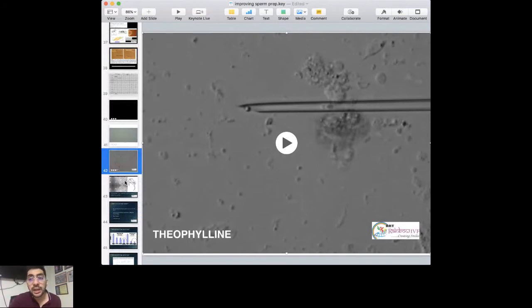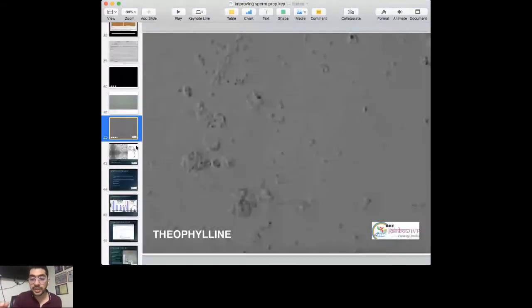Right, so this was mostly everything about sperm preparation. I'll quickly come to processing and freezing the male gamete. So what to use and when, because I'm sorry, I didn't cover the theophylline preparation. Generally, when I am using theophylline, I prefer what Xenia is saying, where I only introduce a drop of theophylline into the ICSI dish. That drop is sufficient to activate the sperms, and it helps me in my ICSI procedure. It does not utilize a lot of theophylline either.